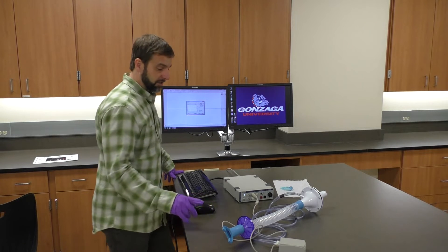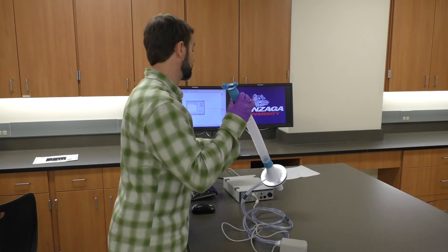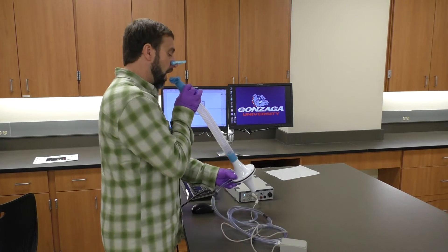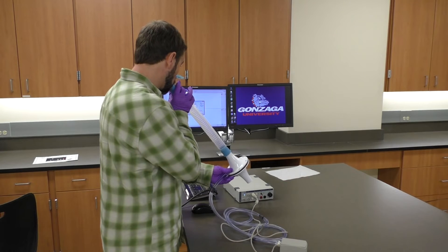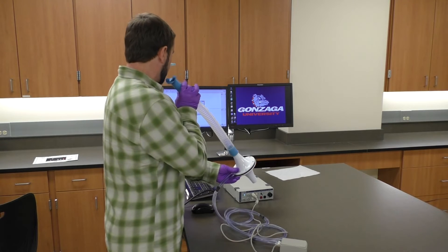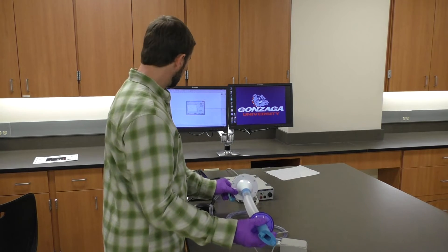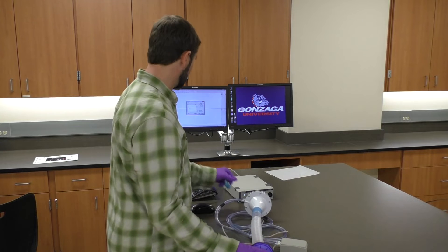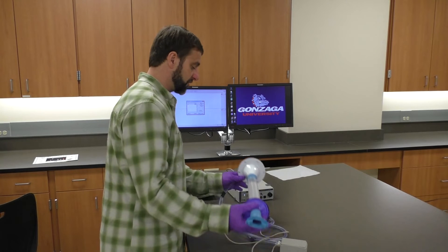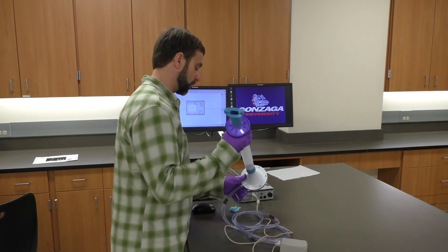We want to check that we're getting deflection in the right direction. When I exhale there should be a downward deflection, and when I inhale there should be an upward deflection — exhale first, then inhale. When I tested it, exhaling went up and inhaling went down, so I'm going to click 'invert' to fix this. The other fix is to switch the blue adapter to the other side of the flow head; either works equally well.